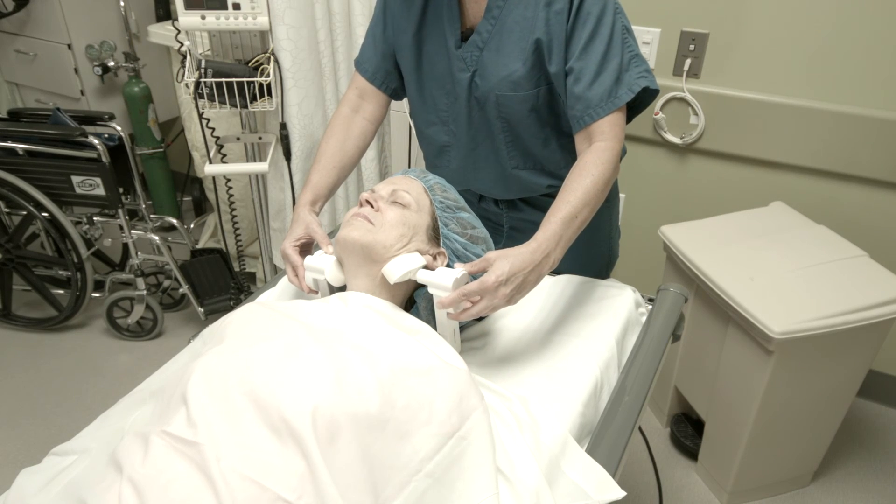The GED cannot be used in the lateral position. Although you can tilt the angle of the jaw, the patient cannot be in the lateral position for this device.